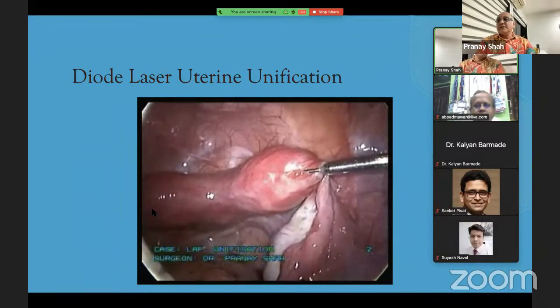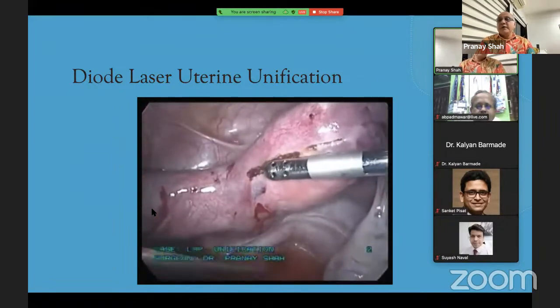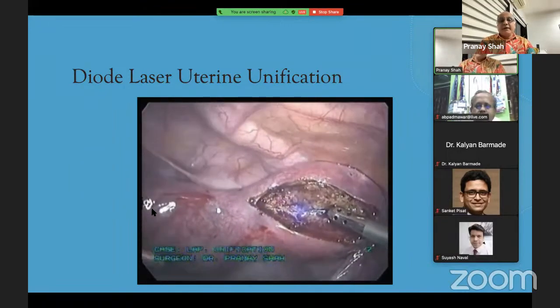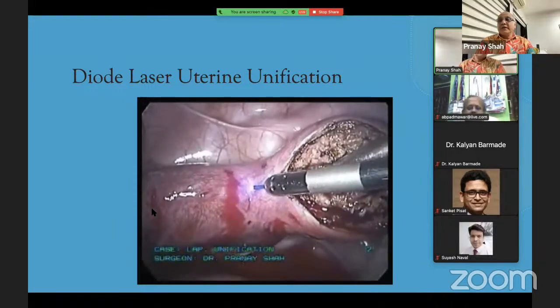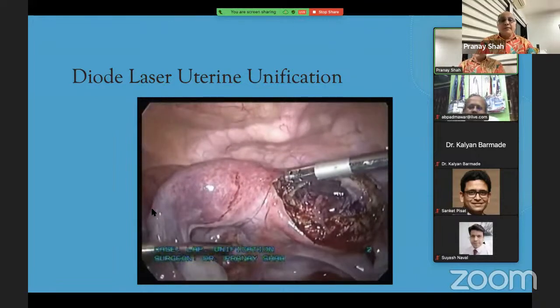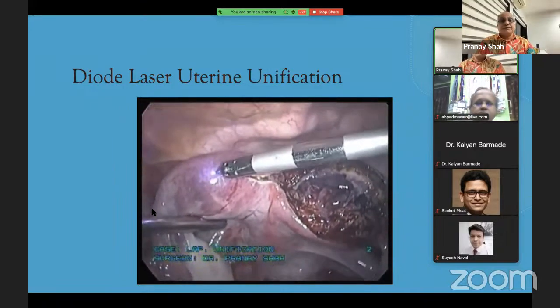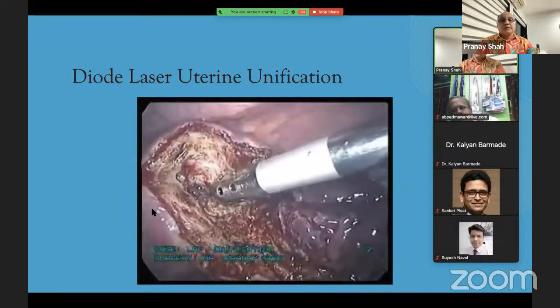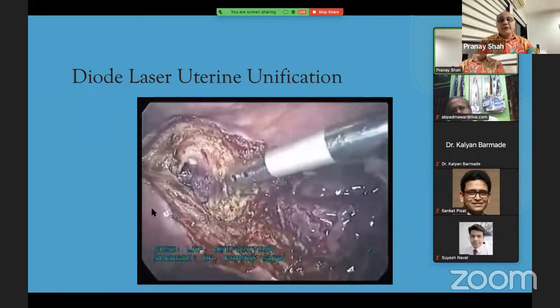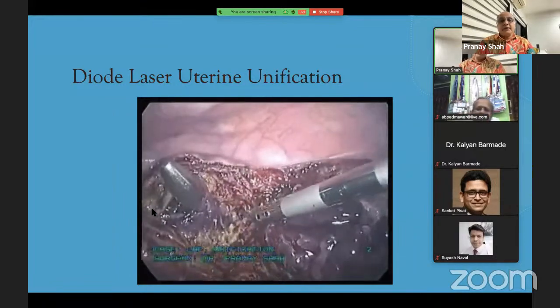A video of one of my cases of bad obstetric history with a bicornuate uterus, where I used the diode laser to incise the myometrium. The laser fiber emitting a blue color is seen. Notice the clean incision and the absence of any bleeding while the myometrium is being incised, and also very minimal coagulation of the edges, thus preserving the myometrium in this delicate surgery. Once the partition between the two horns has been completely excised, the two horns were unified using interrupted sutures.